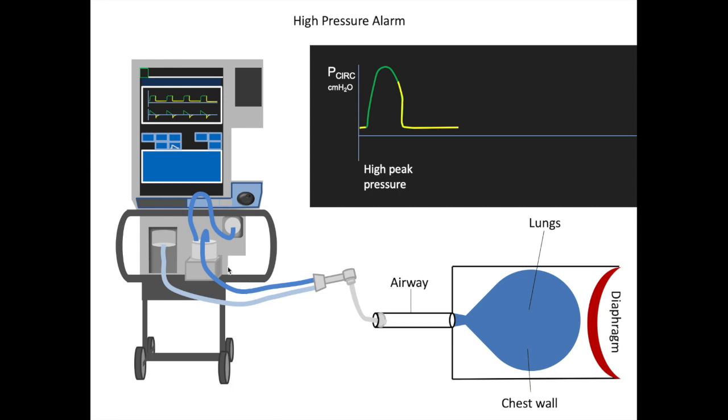It's coming from the airways, which consists of the tubing between the patient and the ventilator, the endotracheal tube, and the patient's airway itself, which is everything from the end of the trachea with the endotracheal tube in it all the way down to the main stem carina and the small airways all the way out until you get to the respiratory bronchioles.